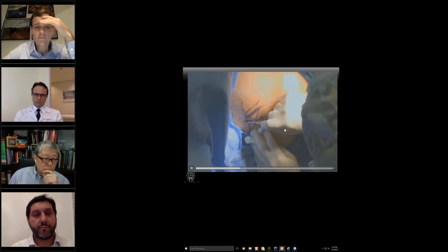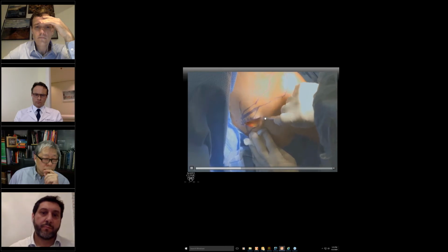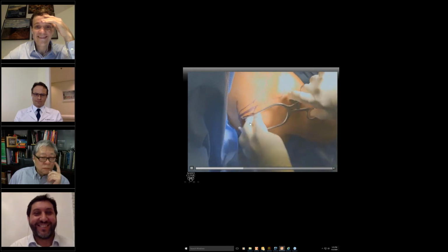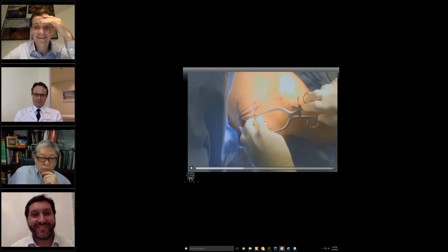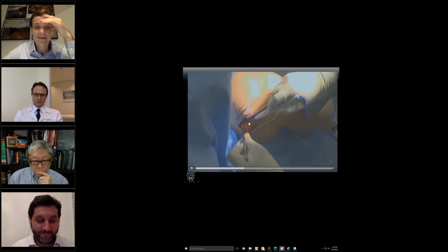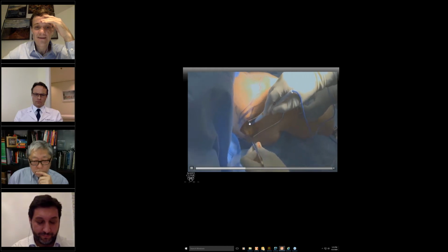This is another patient, also very little cropping, but this patient is more fluffy. Remember, this is fluffy 3. This first patient was fluffy 2, okay? Now, the same. These are the exact steps. Incision, put a retraction. If there's any bleeding, I will cauterize it. Then there's fat. I pull on the fat. The same exact steps. I pull on the fat.